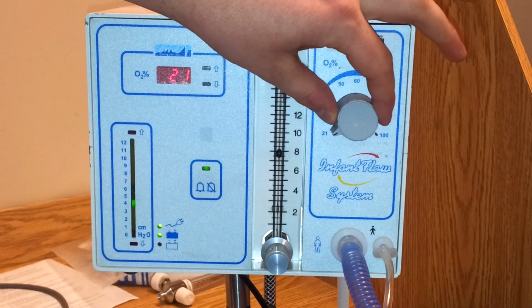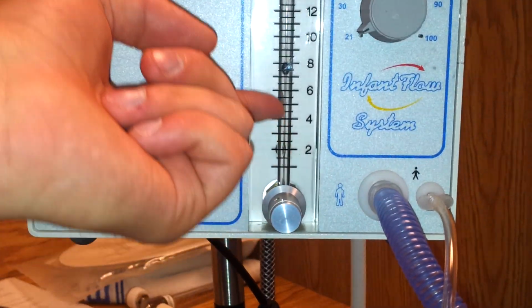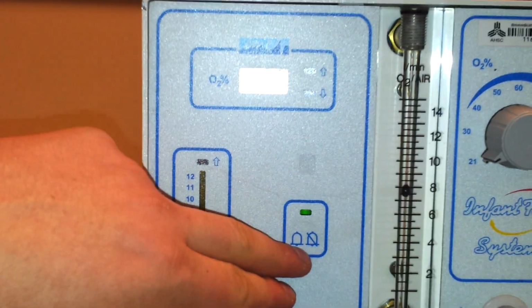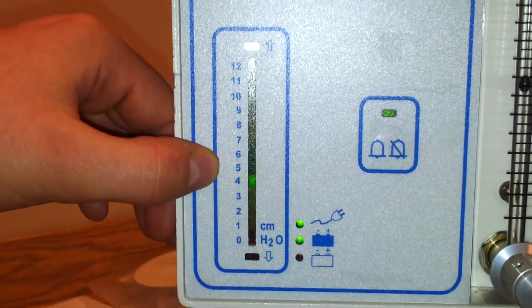So you can select your FiO2 right here. You select your flow right here with this little knob and you can see the flow, what it's set at. There's the alarm button, we'll go over that afterwards. There's what the FiO2 is actually reading and what the CPAP level is.